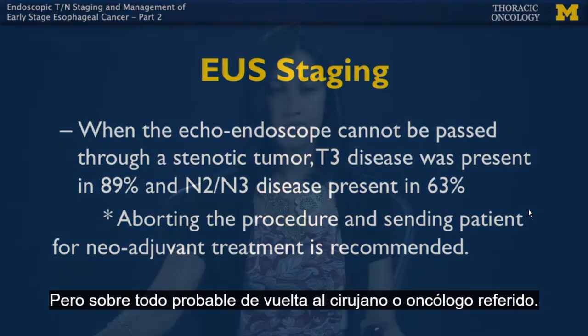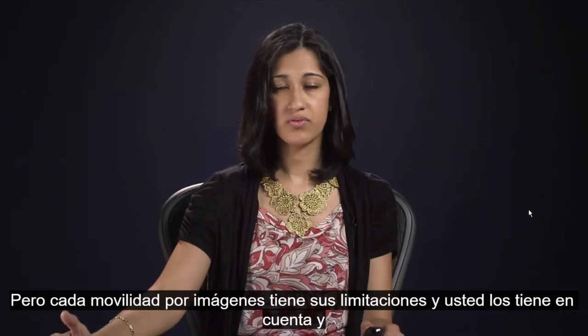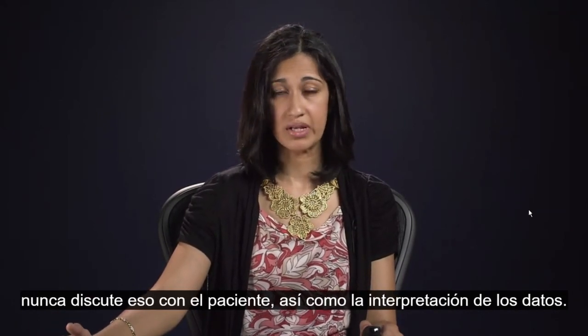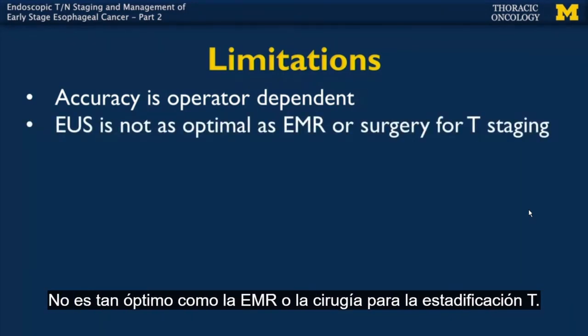What are the limitations of EUS? Because I'm thinking about all the glories, but every imaging modality has its limitations, and we need to keep those in mind when we're discussing this with patients, as well as interpreting the data. Obviously, endoscopic ultrasound is an imaging study, just like any transcutaneous ultrasound, and is operator dependent. It is not as optimal as EMR or surgery for T-staging.